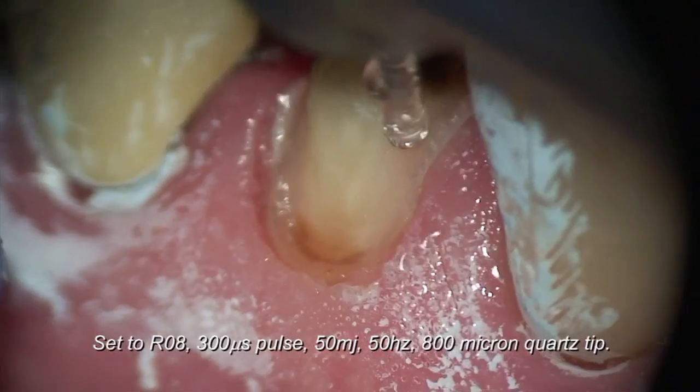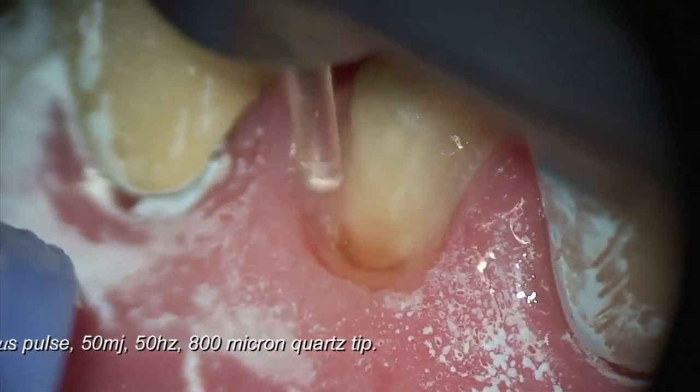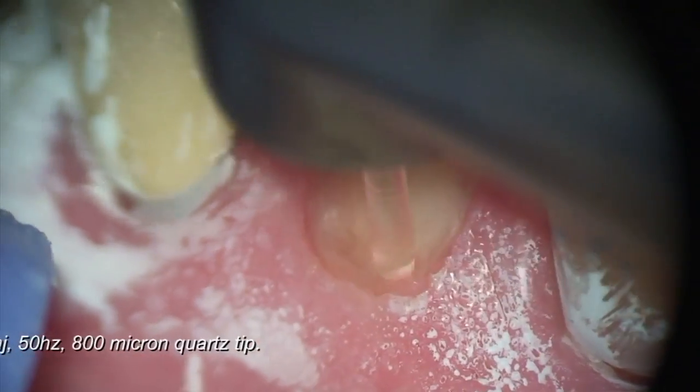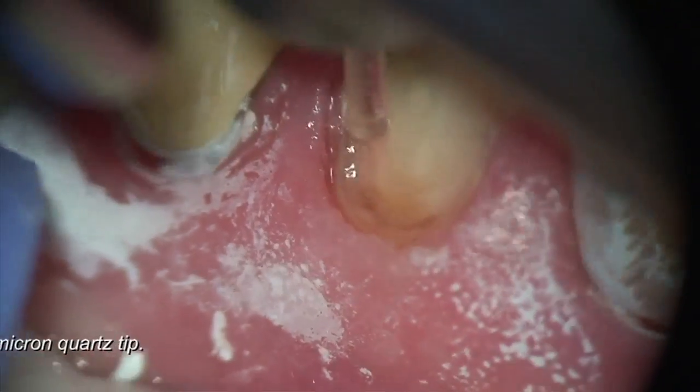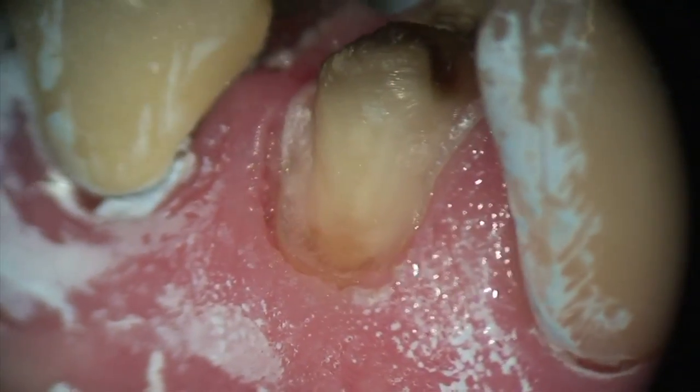Setting the laser at a very high hertz or repetition rate, I'm able to smooth the margin very easily and very efficiently, without having to take and put a handpiece in. Patients like the fact that I use the laser instead of the drill in this case. It's very simple, and we teach you how to do this in training.